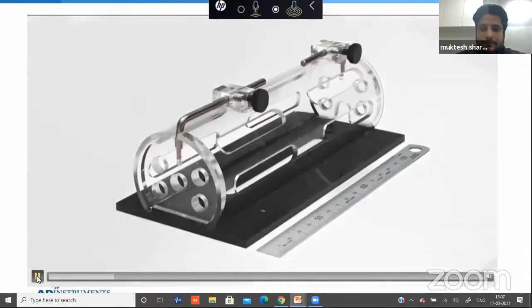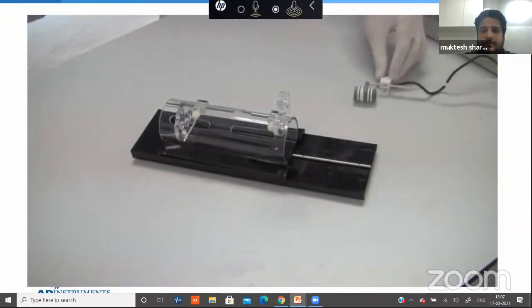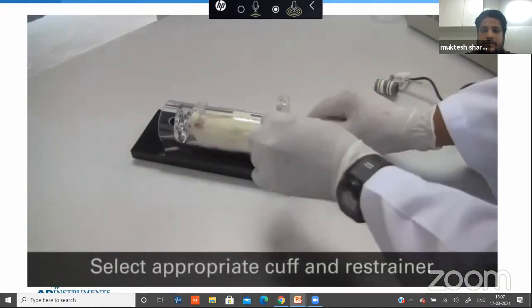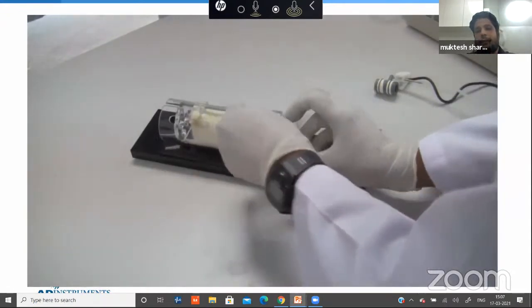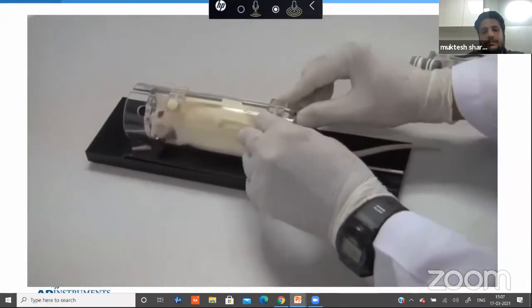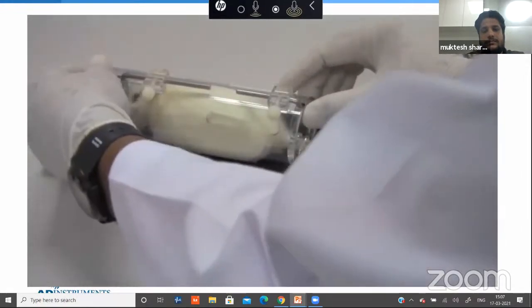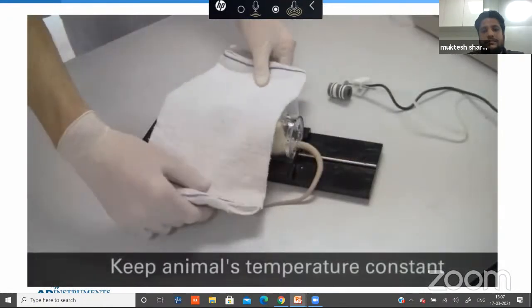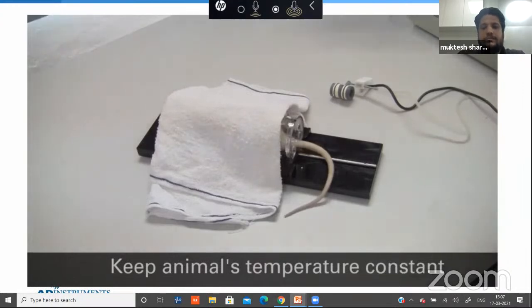Recording from a rat. Before performing blood pressure measurements, the subject animal must be introduced into an appropriately sized restrainer. In this instance, the rat weighs 210 grams, and we are using the rodent restrainer for rats weighing 180 to 320 grams. Once the rat has been introduced into the restrainer, the length of the restrainer can be adjusted to comfortably restrain the animal. A towel is placed over the restrainer to help calm the animal, and a lamp is placed close by to keep the animal warm.